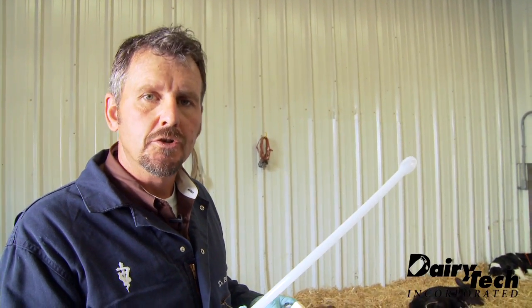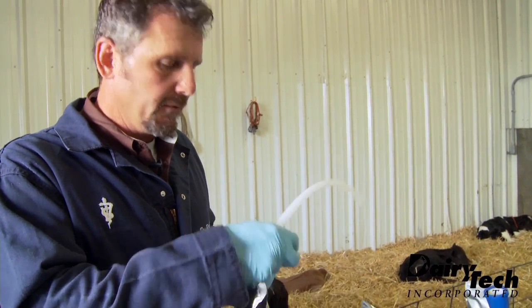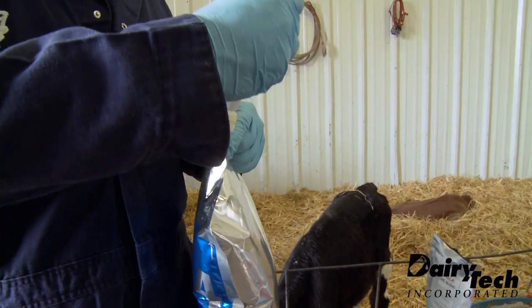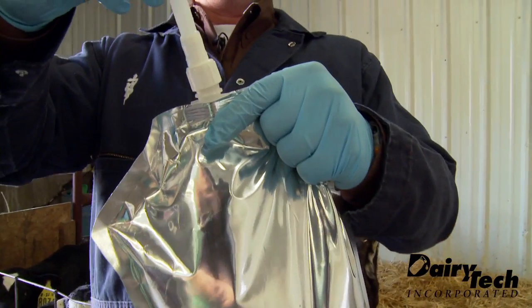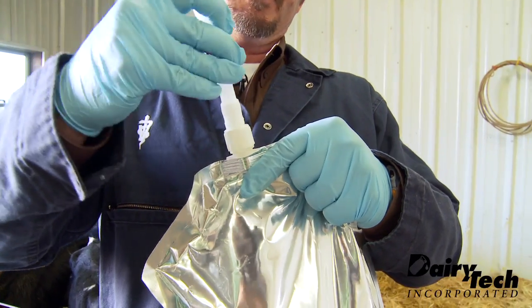For the times when we want to tube the calf and feed the calf through the oral esophageal tube, the procedure is pretty simple. Simply remove the calf from the bag, thread on the esophageal tube, and get a nice tight fit on that.